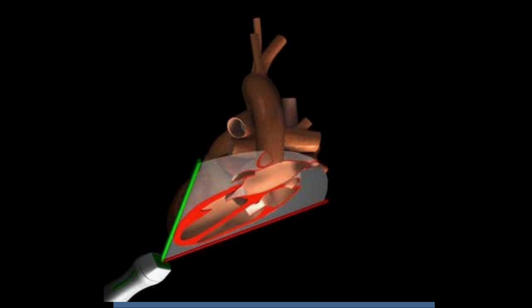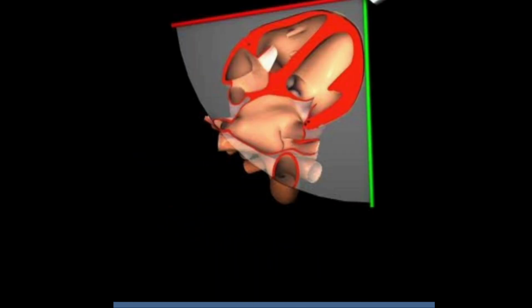And then what we're going to be seeing on the right side of the screen, where the ultrasound marker indicator is found, is going to be the left side of the heart. So essentially, if I rewind this video just a tiny bit and we go here, this is the picture that we're going to get, is that the probe is sitting right in the middle of the screen.